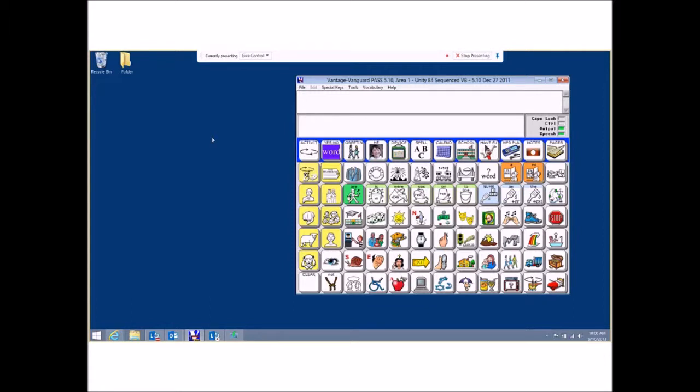So to quickly introduce the device so that you'll understand what this video and future videos talk about, the device is made up of two main components where the buttons are. This component right here in the blue area where the mouse pointer is moving, that's called the activity row, and then down below is what's called the core page. Anytime Jake uses the device, it's going to start out looking just like this.